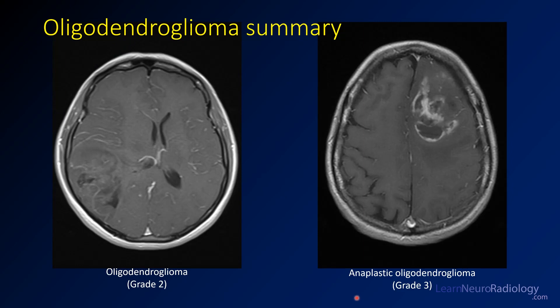Here's a summary of oligodendrogliomas. The grade 2 oligodendroglioma shows very little enhancement, in contradistinction to the grade 3 case, which has a ton of enhancement and a little more mass effect — indicating the higher grade.